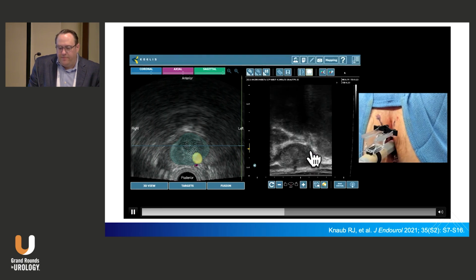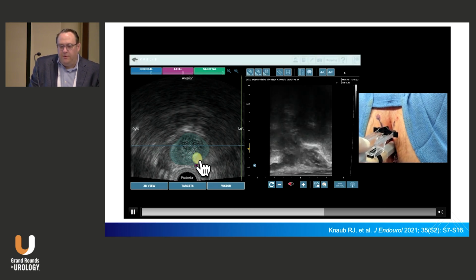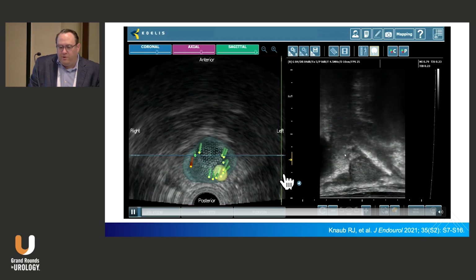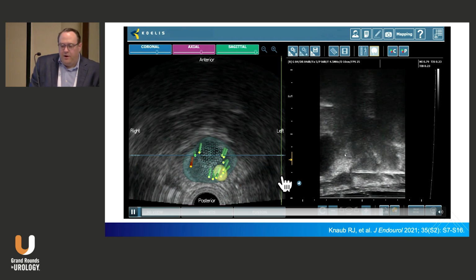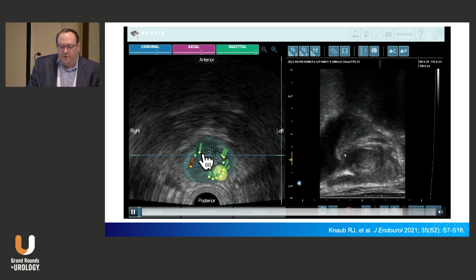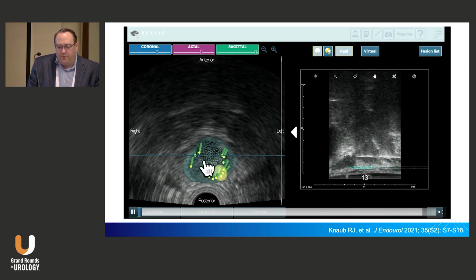So, yep, I'm in the correct view. So now it's just a matter of putting the needle in, hitting fire, doing an updated 3D ultrasound, and you'll see my needle, as where it actually was, is going to be updated on this image here. You could see I was a little bit lateral there, but overall very accurate recording. And then you just do this in a templated fashion to capture cores from the entire peripheral zone of the prostate. And you could see that your reference ultrasound, your reference volume rather, gets populated with those cores as you go.